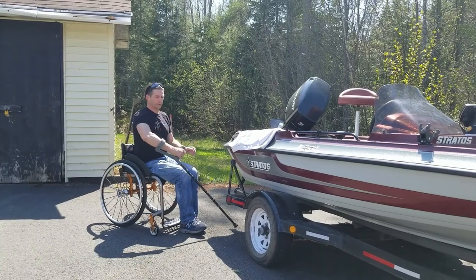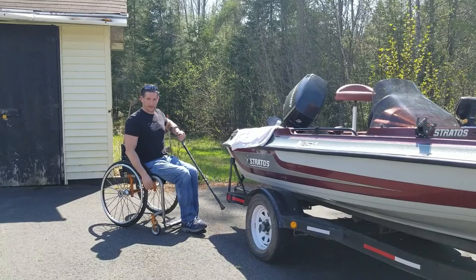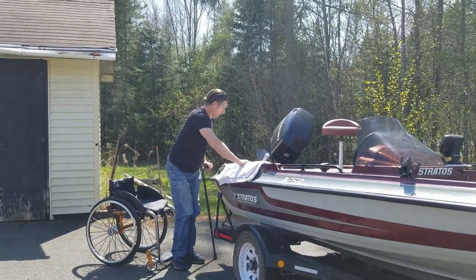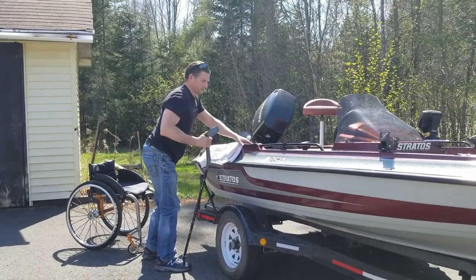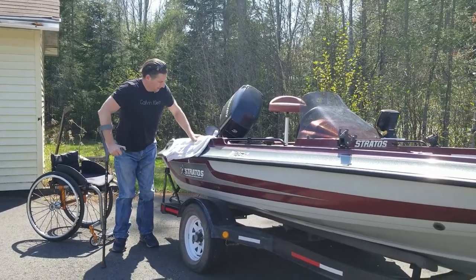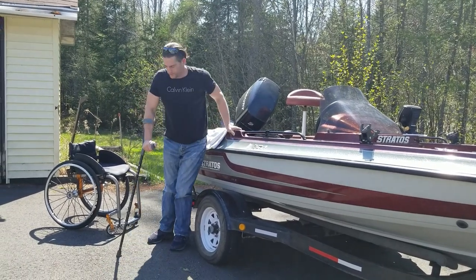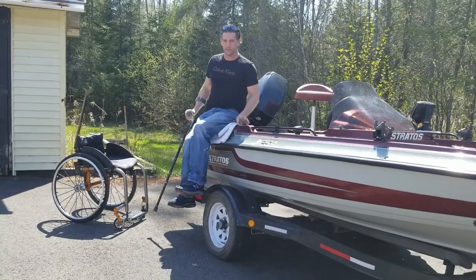I use my forearm crutch, put my brakes on in my chair, and pop myself up. Now there's a step here but I really don't use it. I just kind of pop myself up like this onto the edge of the boat.